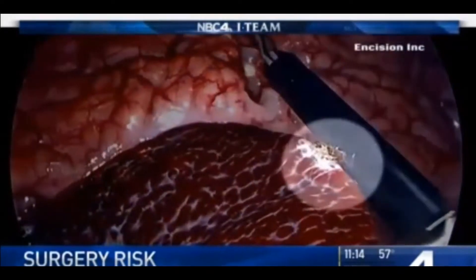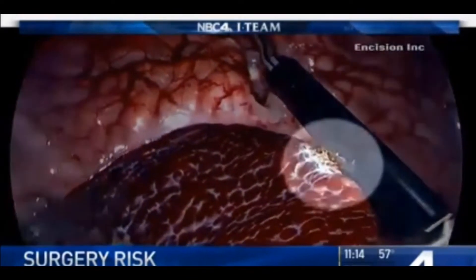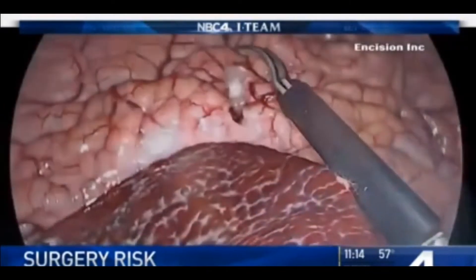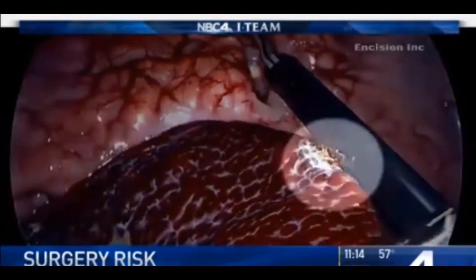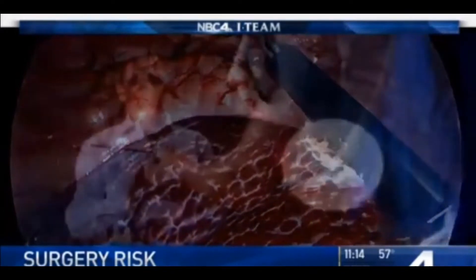This is a sequence of videos showing targeted tissue where they're cauterizing inside the sterile cavity of a patient. On the far right, you can see arcing that damaged the insulation. This is another example of damage to an organ — this one is damage to the liver. Typically you don't pan out when doing these procedures, but when you do, you could find damage in the insulation more towards the medial or proximal end of that device.